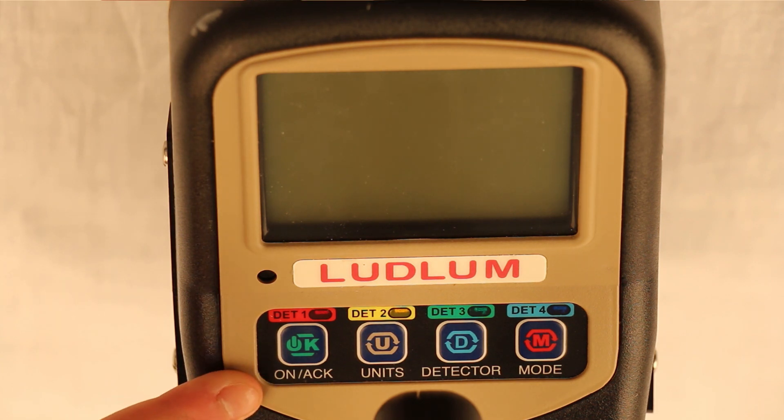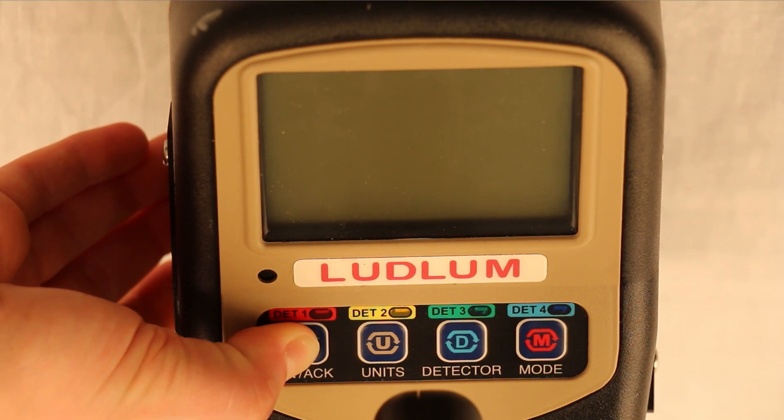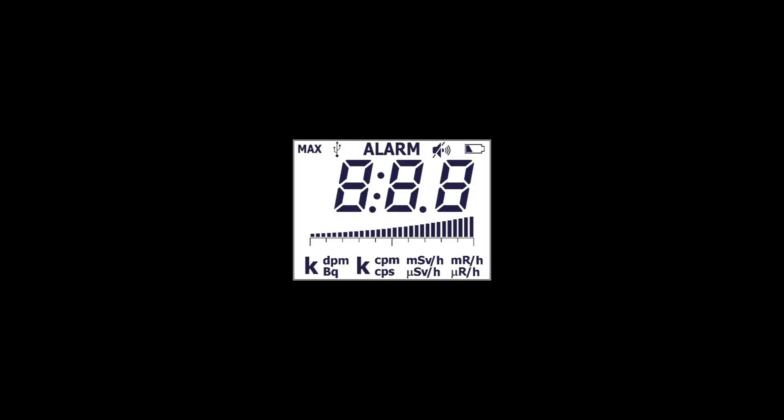The Model 3001 has four buttons on the face of the instrument. The on-act button is used to turn the 3001 on and off and to acknowledge an alarm. Turn on the 3001 by pressing the on-act button for about one second. The 3001 will go through a boot up process and the display will flash all the segments of the display, then it will show the firmware number followed by the battery voltage.